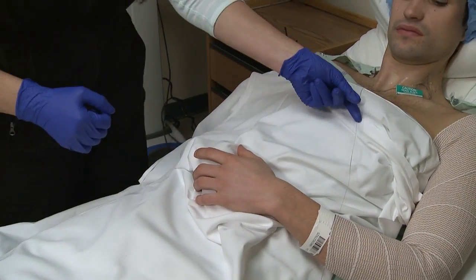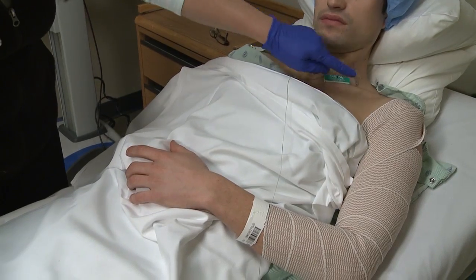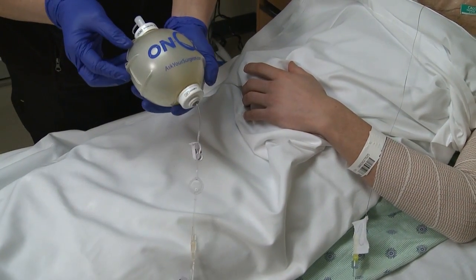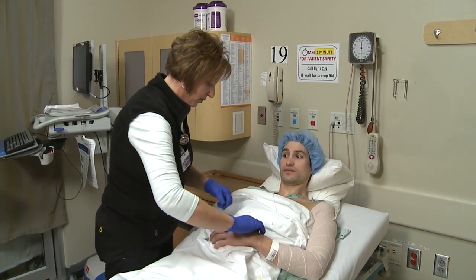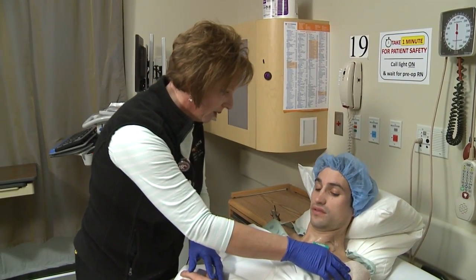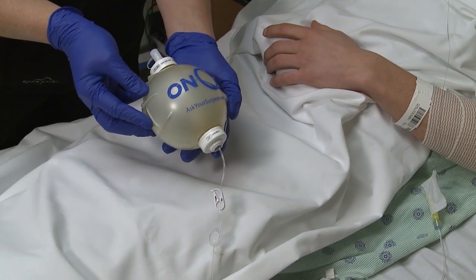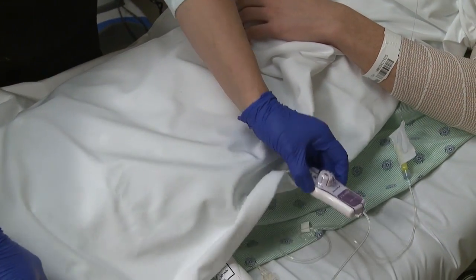The continuous nerve block you have is a tiny plastic catheter infusing local anesthetic to the nerves that control the part of your body where surgery was performed. We will send you home with a disposable pump that will continue this infusion for several more days. This way, we can keep you comfortable at home without having to use a lot of narcotics, and thereby avoid or reduce their undesirable side effects. In this video, I'll explain to you how the pump works and how you can customize it for your needs as you recover at home.